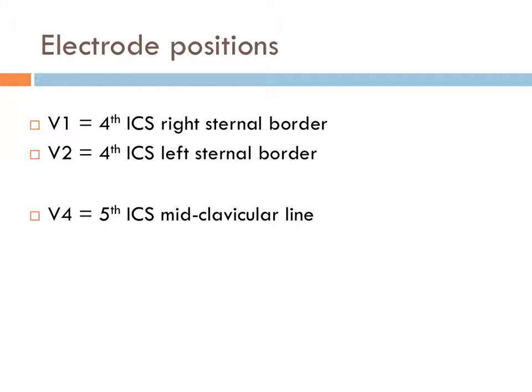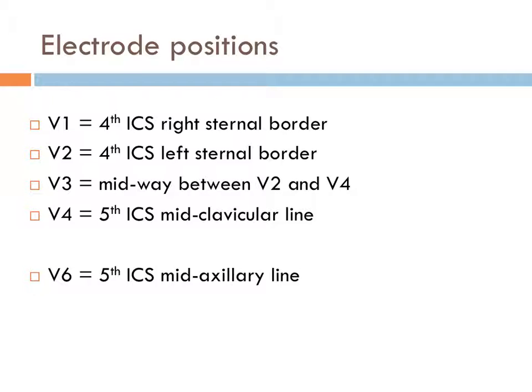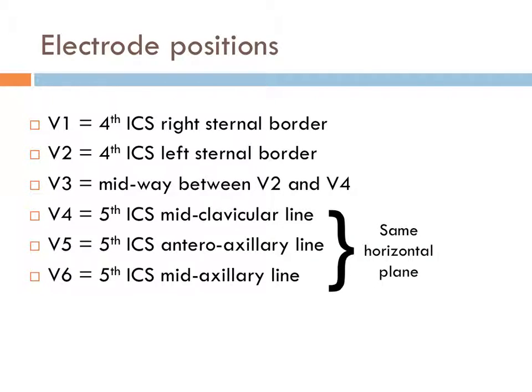Then you're going to put on V4 in the fifth intercostal space, mid-clavicular line, V3 between the two, V6 mid-axillary line, V5 between 4 and 6 or at the anteroaxillary line. Worth noting that 4, 5, and 6 should be in the same horizontal plane. You don't need to follow the rib interspace going up, as it will. Just go straight across. So 4, 5, and 6 should be in a straight line perpendicular to the sternum.